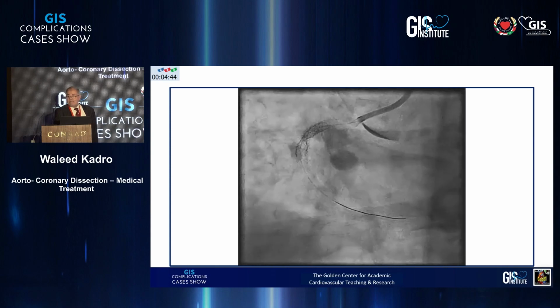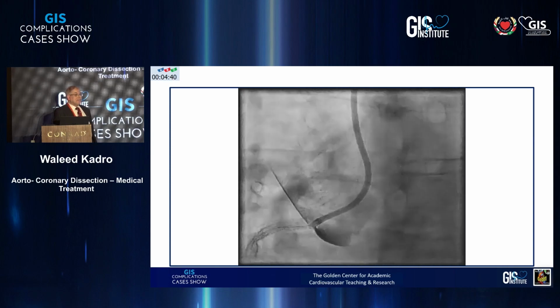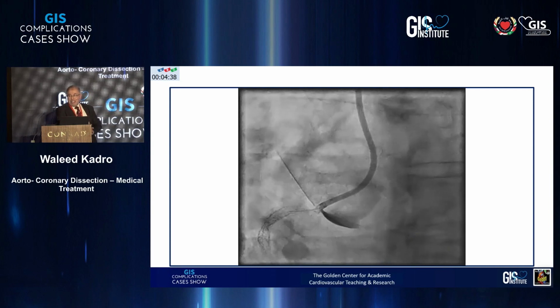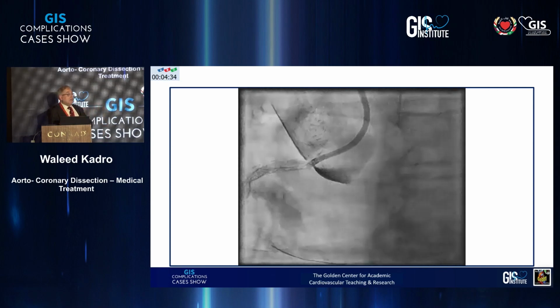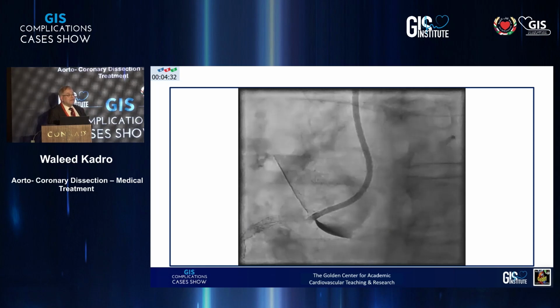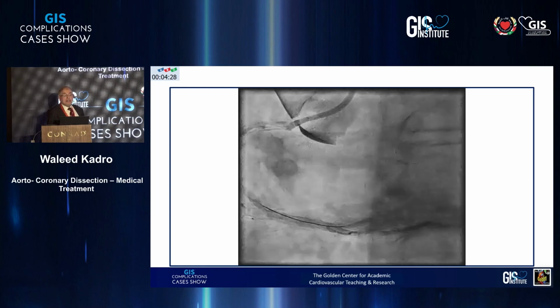Okay, great. So this is aortocoronary dissection. This is the true case of aortocoronary dissection. So now, what? Okay, now I have the wire.